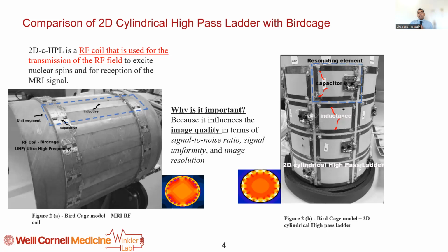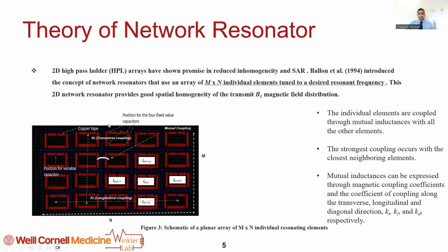And it is important because, as I've shown you, it helps you to produce a more uniform field distribution, and also improves the signal to noise ratio. So, as I've mentioned earlier, this design is actually inspired from Ballon et al. 1994. When he came up with the prototype, he does have a pattern on it as well.